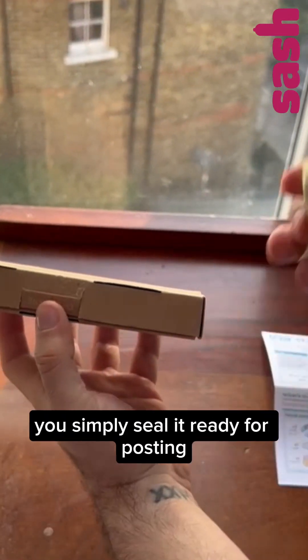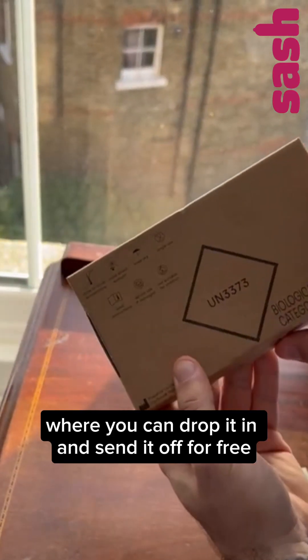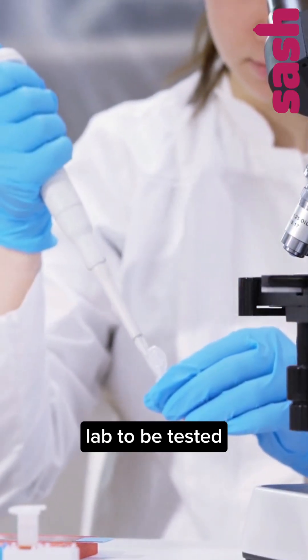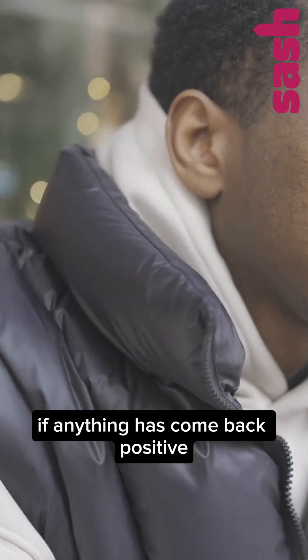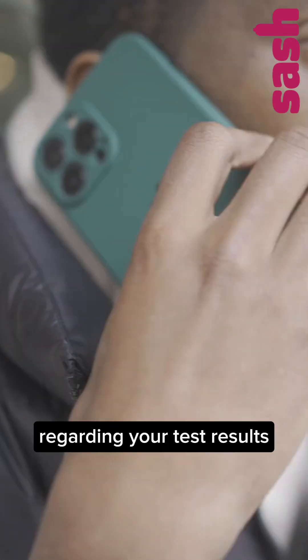Once you've completed your testing kit, you simply seal it ready for posting and take it to a post box where you can drop it in and send it off for free. No need to purchase any postage. Your samples will then make their way to the lab to be tested. If everything comes back negative, you'll get a simple text telling you so. If anything has come back positive, including the HIV test, then you'll be contacted about the next steps regarding your test results.